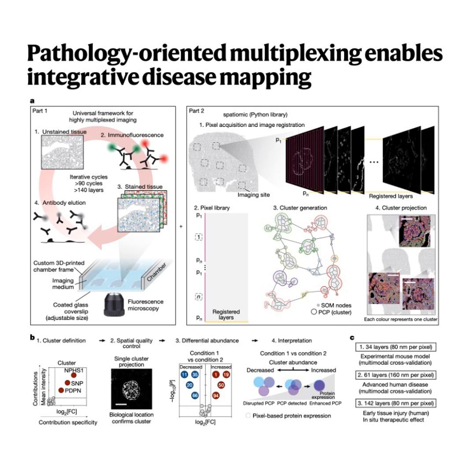And then the software, Spatiomic, analyzes this mountain of pixel data to generate clusters. Yep. And those clusters aren't just cell types. They're these integrative co-expression patterns capturing subcellular location and signaling states. They're essentially the fingerprints of specific biological activities or stresses.